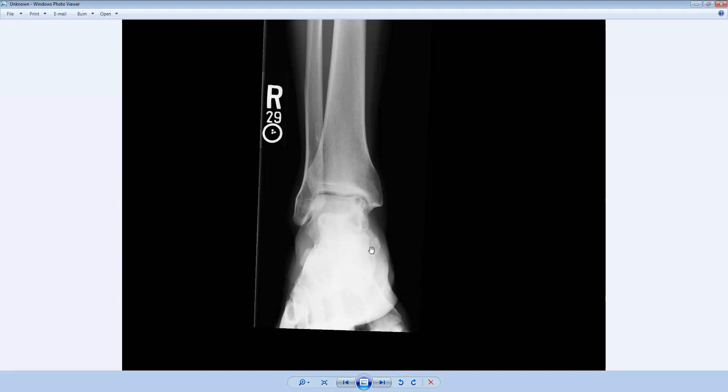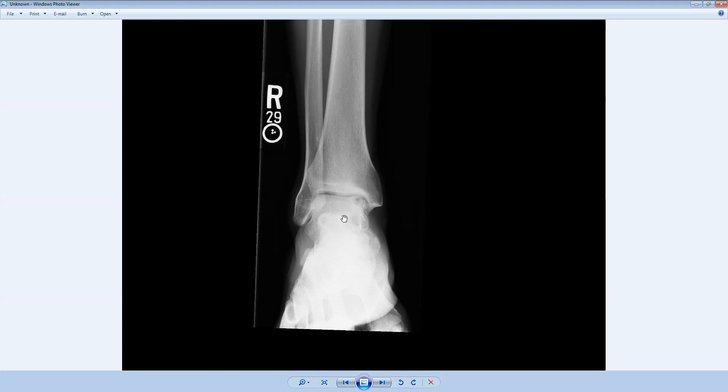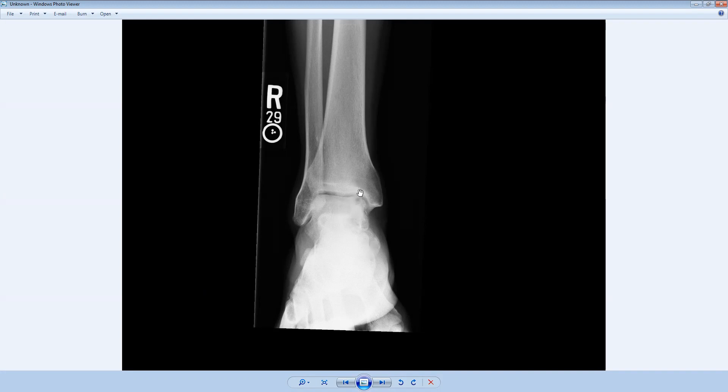Other findings that suggest this may not be osteoarthritis are the fact that usually in a joint pathologic process, we see findings on both sides of the joint. But we don't really see any subchondral cysts or any areas of degenerative joint disease on the tibial aspect of this joint, making degenerative joint disease much less likely in this case.